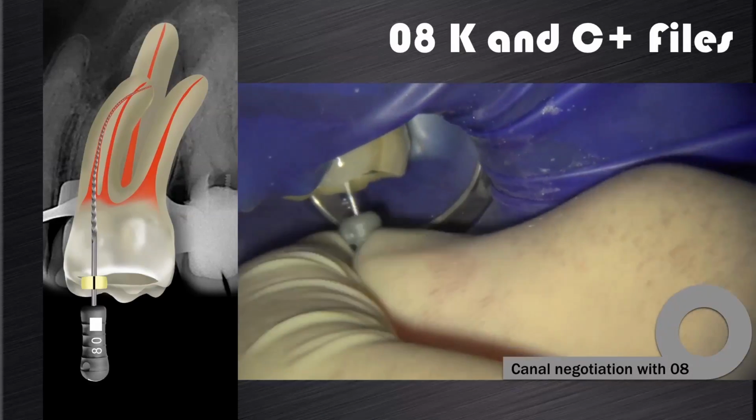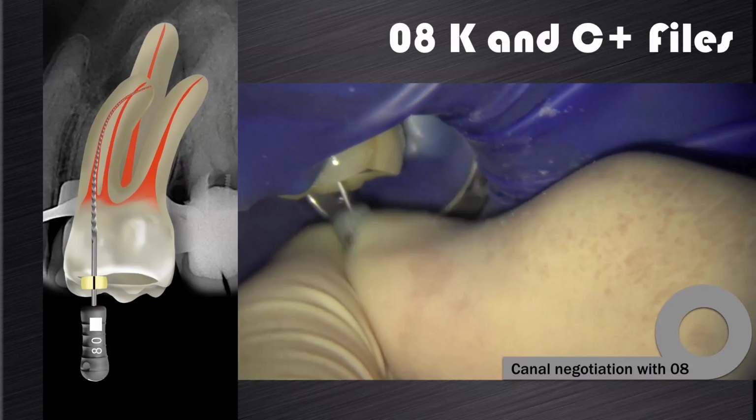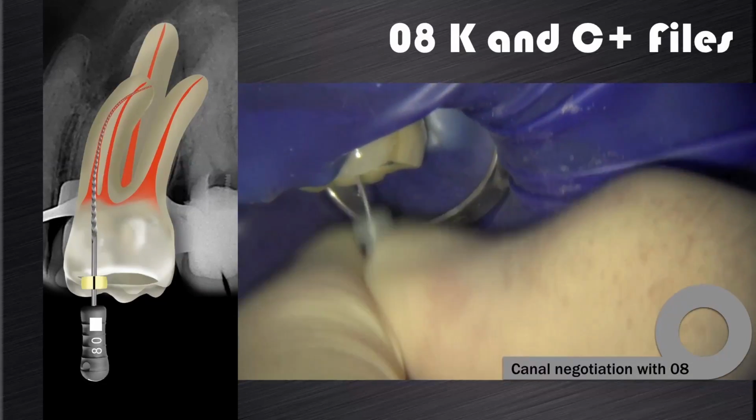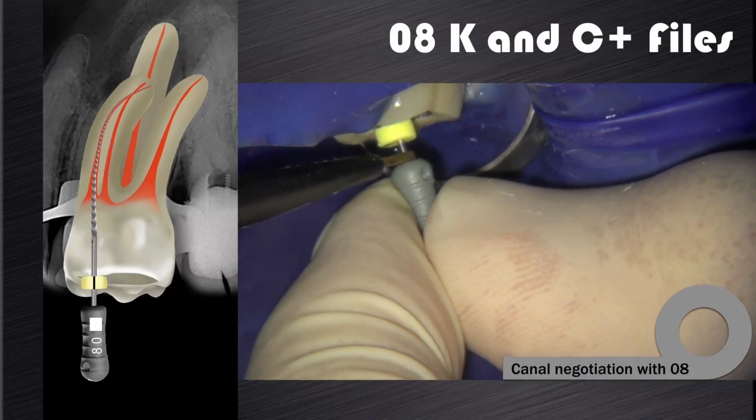On this video clip you can see that I've just achieved patency now. After that I will do my working length using an electronic apex locator.